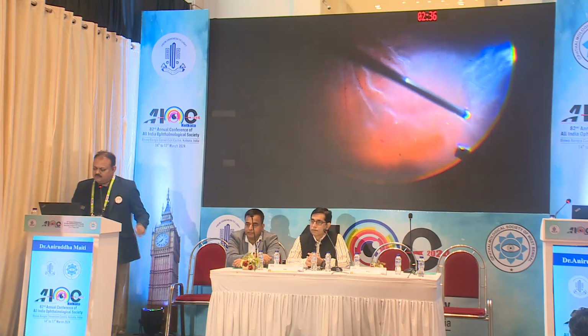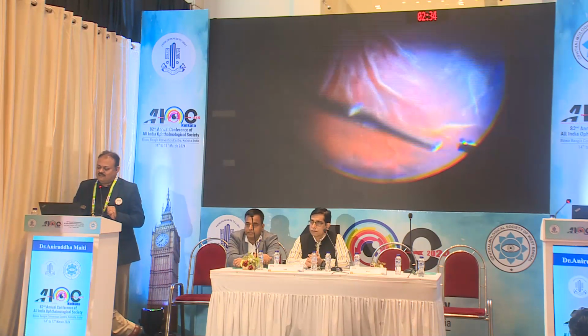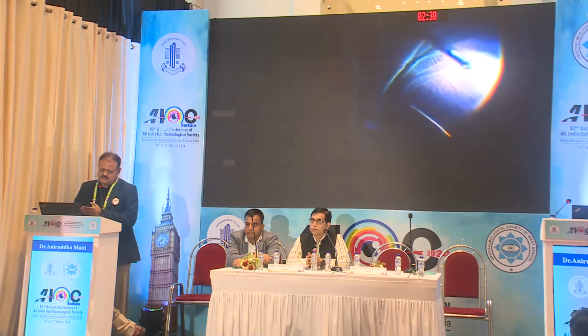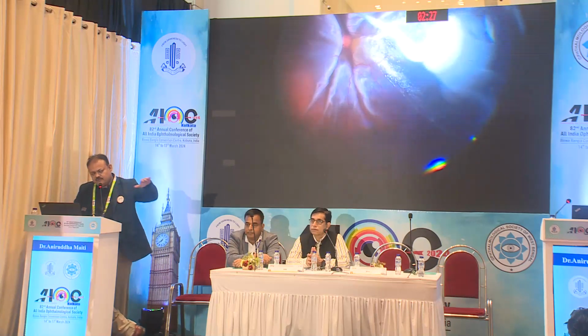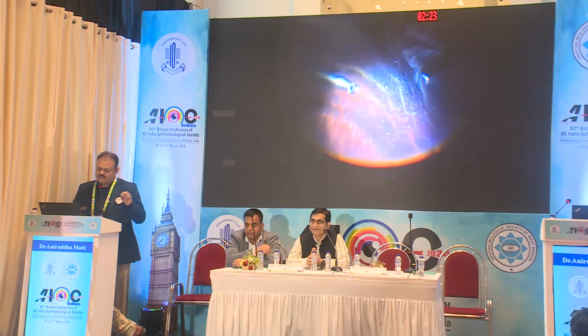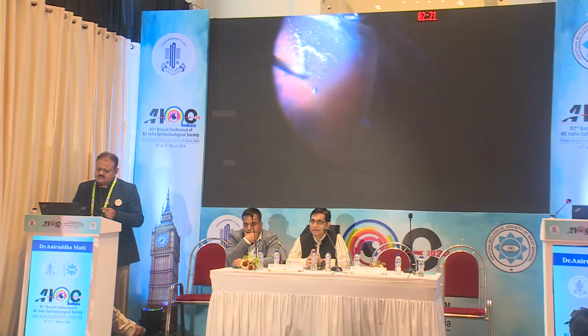Regmatogenous RD cases. There are sometimes cases like this. Bullous RD very close to the retina. You see, with a 20-gauge cutter when you are doing the peripheral vitrectomy, you need to be careful.